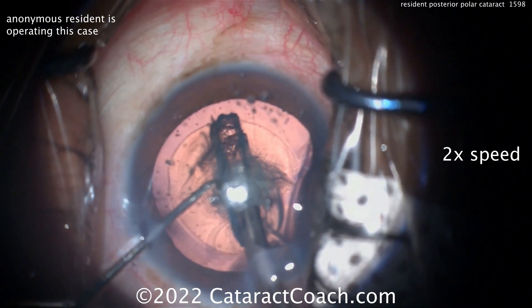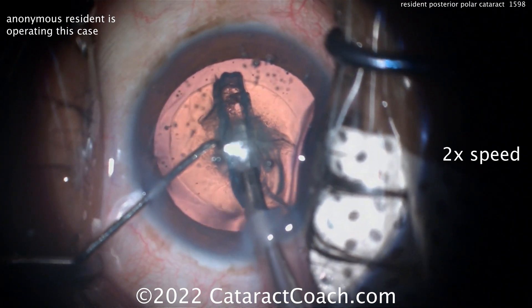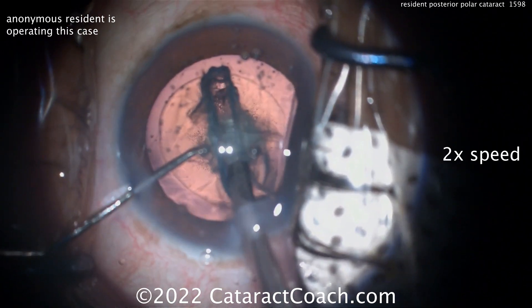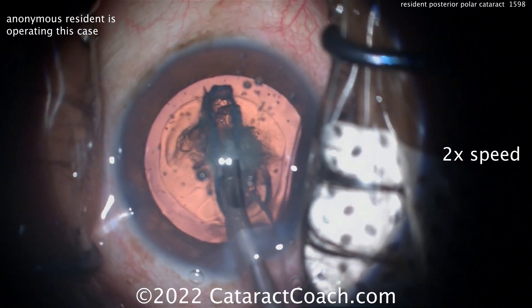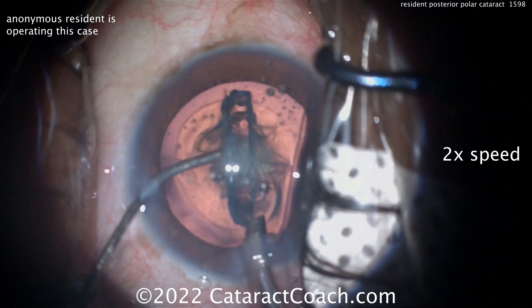A couple of little grooves there — notice no hydrodissection. You can do a hydrodelineation, and I tend to do hydrodelineation for these cases, but you can also just do neither. The posterior polar cataract can cause a rupture of the posterior capsule with hydrodissection, so be very cautious about that.